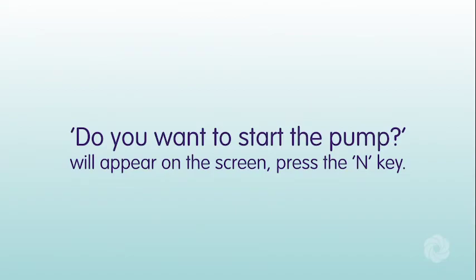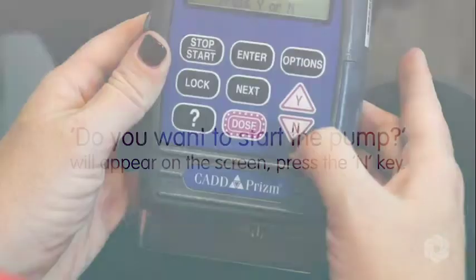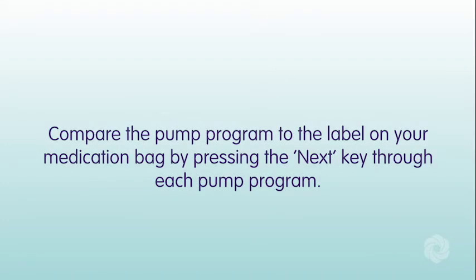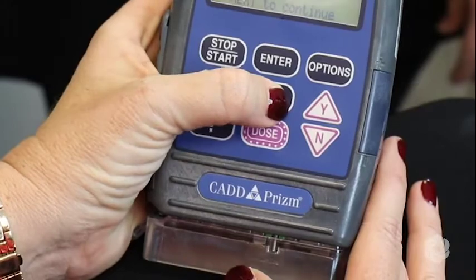You are now prepared to administer your medication. 'Do you want to start the pump?' will appear on the screen. Press the N key. Compare the pump program to the label on your medication bag by pressing the Next key through each pump program.